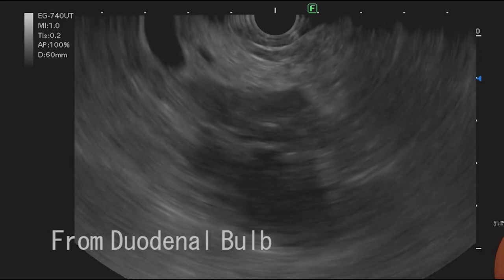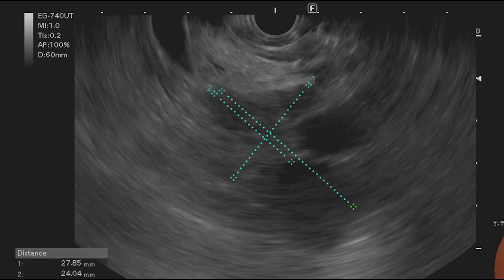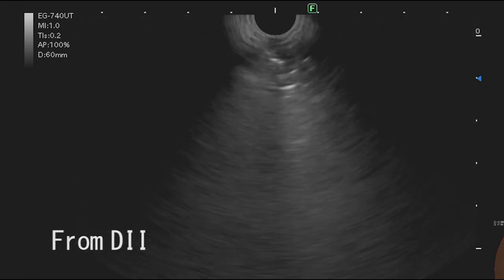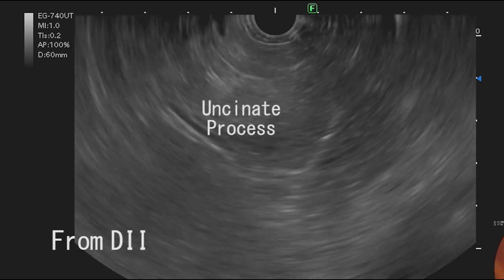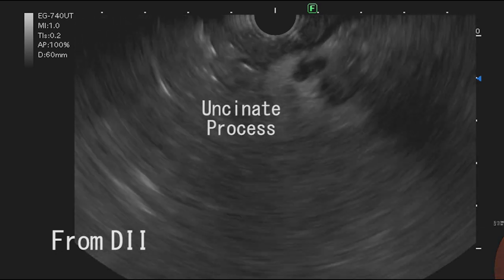Echoendoscopically, the cyst presented irregular contour and margins, with a portion completely anechoic, and a solid component in the proximal part. We then moved to the second portion of the duodenum to strictly face the lesion and to visualize the uncinate parenchyma.